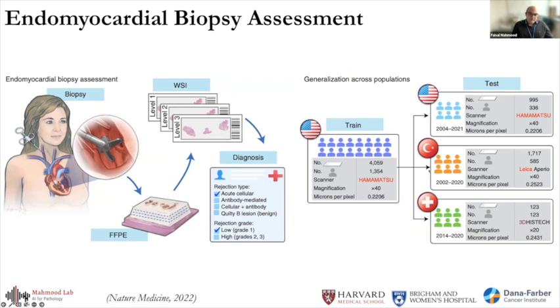cohorts, one that was sent over from a medical center in Turkey. And it used a different slide scanner, different staining protocols and everything. And another one that was sent over from Switzerland using a third slide scanner and very different staining protocols as well. So we had the opportunity to investigate the adaptability of these models in quite some detail.